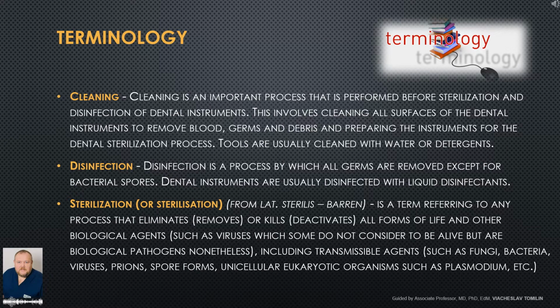Terminology. One of the main responsibilities of healthcare professionals is to create a safe and comfortable environment for their patients. To this end, the American Dental Association, ADA, and the Centers for Disease Control, CDC, have developed protocols to prevent cross-contamination among dental patients. This involves thorough cleaning and sterilization of all types of dental instruments every time they are used on a patient. Before moving on to how cross-infection is ensured in dental practice, we will introduce you to some common terminology.